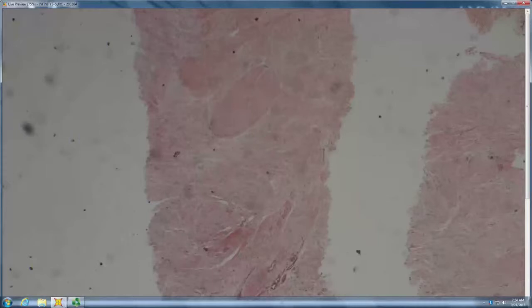Smooth muscle hamartoma. Smooth muscle hamartoma is when they're all lined up looking like excessive erector pili, but all in normal orientation. Is this all in normal orientation or kind of haphazard? So more haphazard. So maybe a punch out of a leiomyoma rather than a smooth muscle hamartoma.